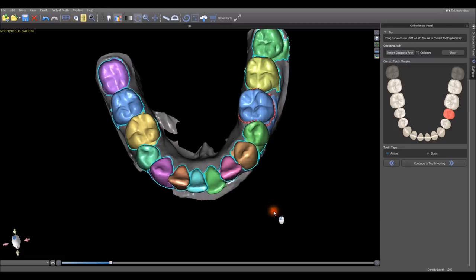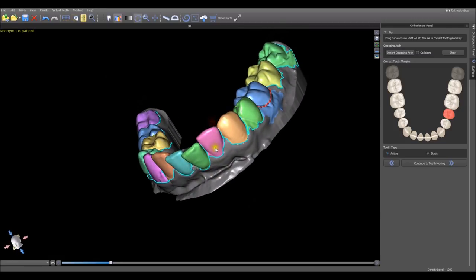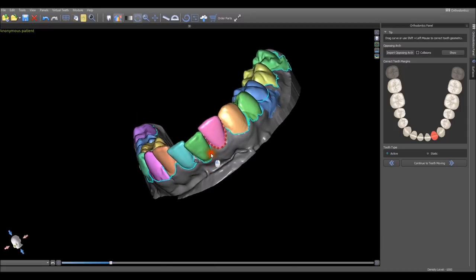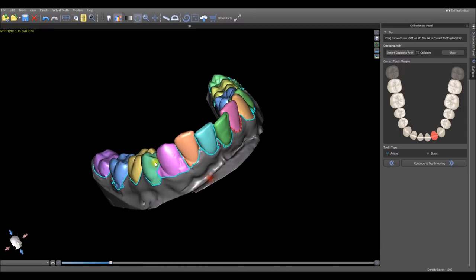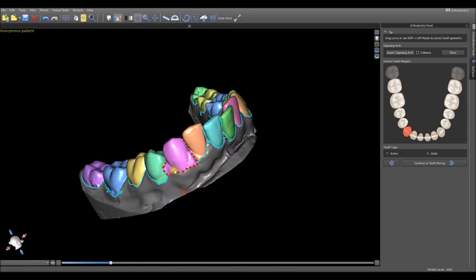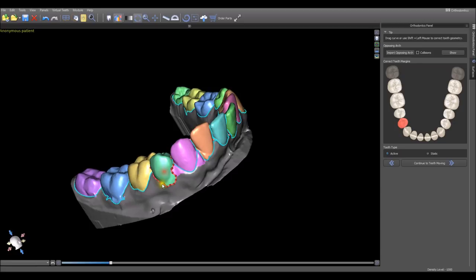The software provides an initial segmentation. Clicking on a tooth with your left mouse button makes it active, and the dots can be grabbed and dragged with the left mouse button to be manipulated. Or simply activate the tooth and hold down the Shift key while you left drag to redraw the curve. We're going to go around the arch and do this for all the teeth.